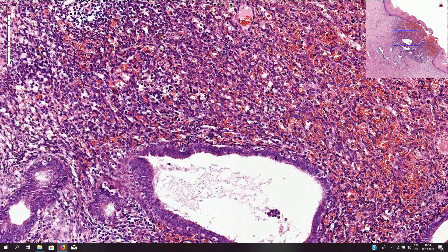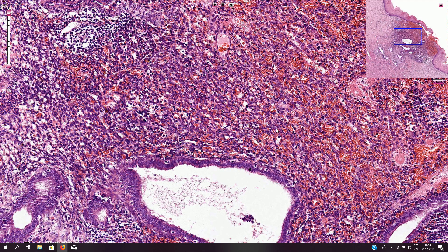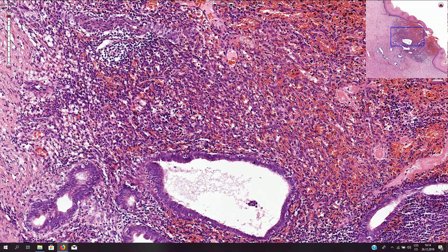Here we have multiple erythrocytes in the stroma, which is a sign of bleeding. Sometimes we can see older bleeding where we find a lot of hemosiderin-laden macrophages, or siderophages.